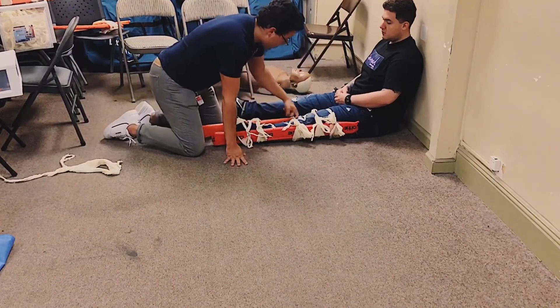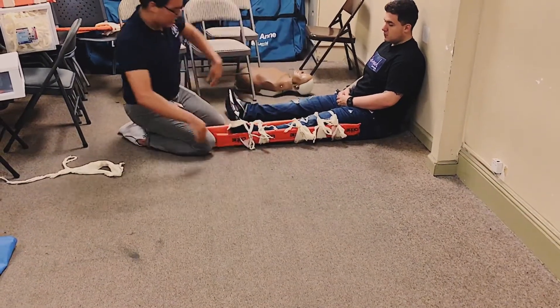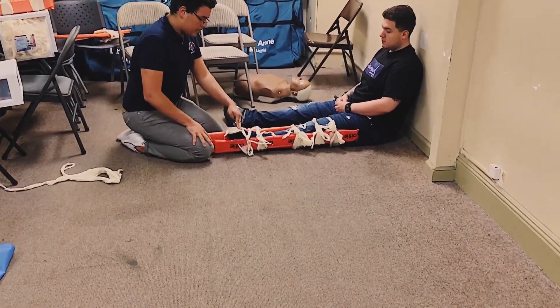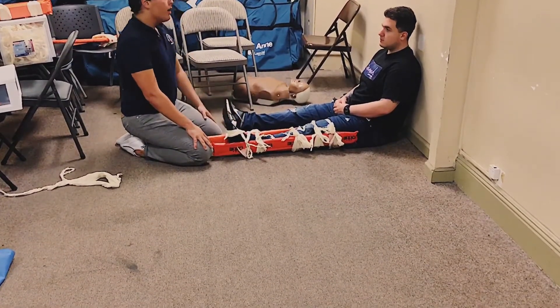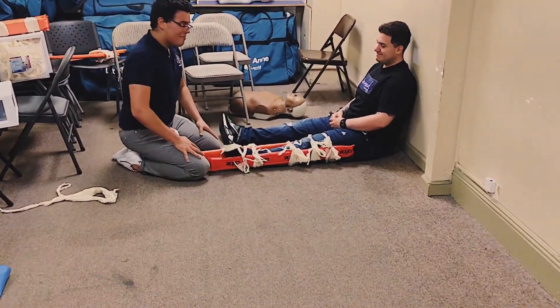I'm going to go ahead and check all of my cravats — they are tight. I'm going to go ahead and reassess: pulse, motor — wiggle your toes — and sensory, which toe? PMS is intact.